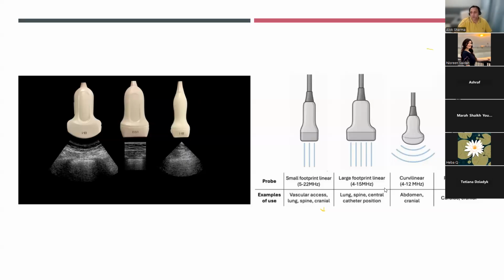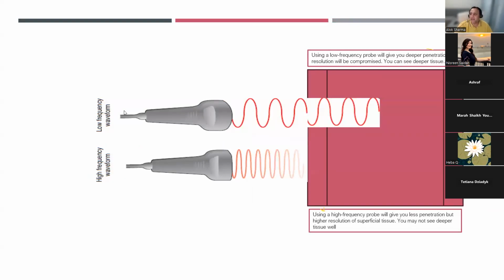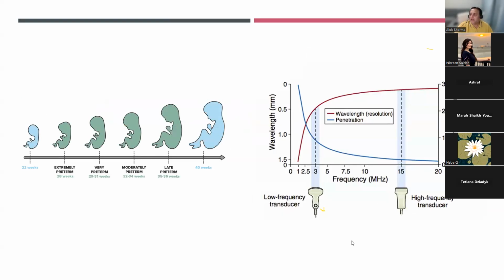So, an S9 probe, which is a sector probe, can also be used for the purposes of actually looking at the lung. The only problem that you're going to have, and again, I'm just taking you back to this baby, if you use a sector probe, which is a square probe, which is quite a small footprint, and this is the baby's ribs. Now, a linear probe will give you a large footprint when you use it perpendicularly. So you'll be able to see 3 ribs, 4 intercostal spaces. But if you use a small sector probe, then really from my perspective, you're only going to be able to see 1 rib. It means that you're going to have to take multiple images to be able to get the whole of the lung architecture.